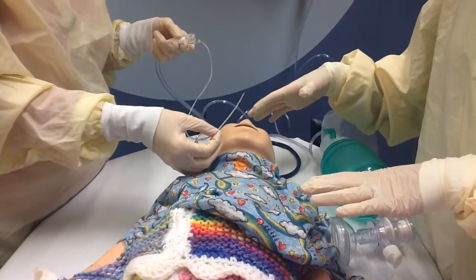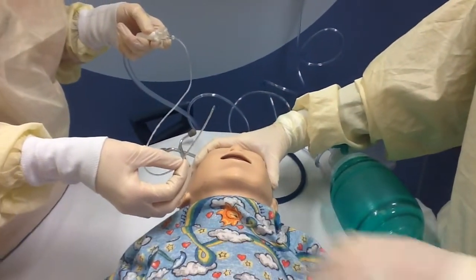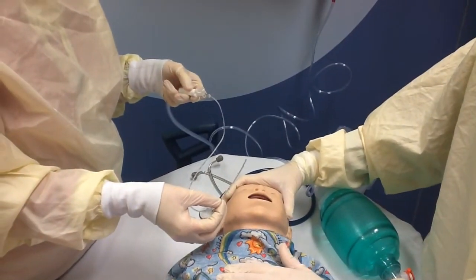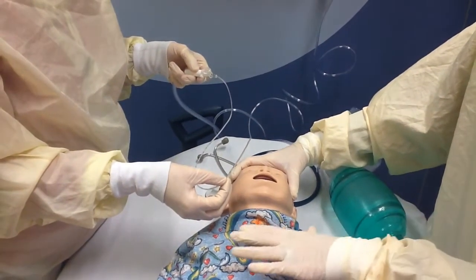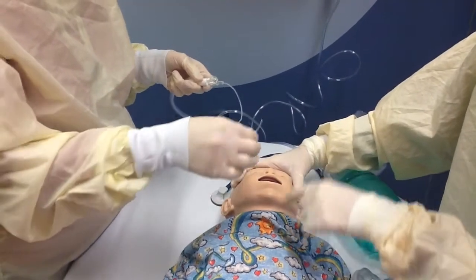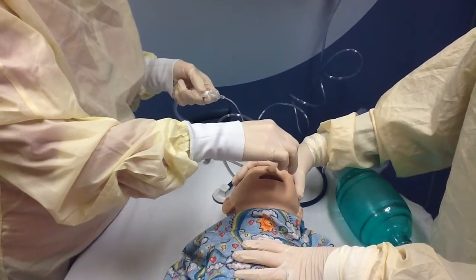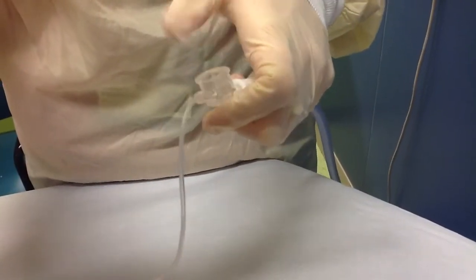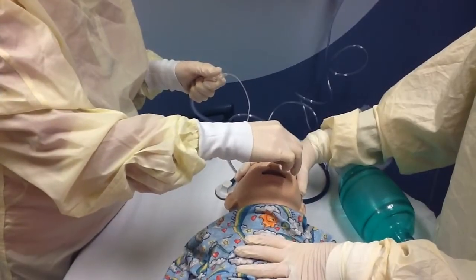For suctioning the patient, it's sometimes a good idea to have a second person available to hold the patient still and to have the AMBU bag ready if needed. You're going to keep the AMBU with the oxygen near the patient for the procedure. With the catheter vent open, you're going to put the suction catheter into the naris and advance it while the patient's inhaling. As you're coming out, you're going to constantly hold suction over the vent while gently withdrawing the catheter.